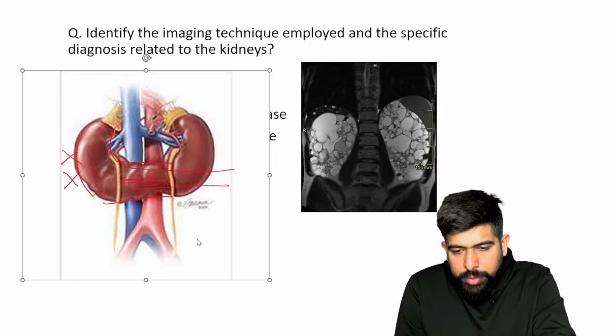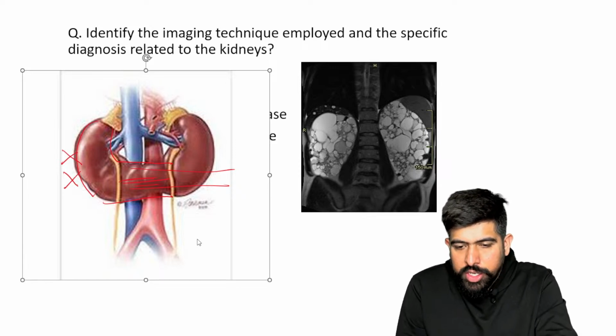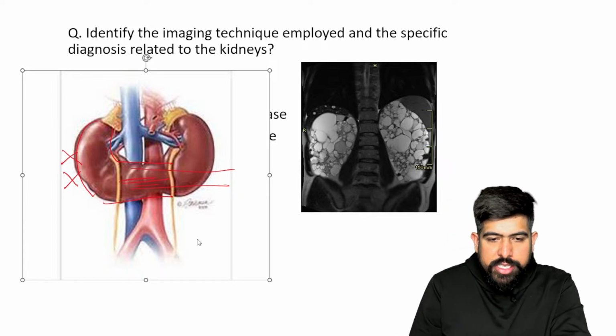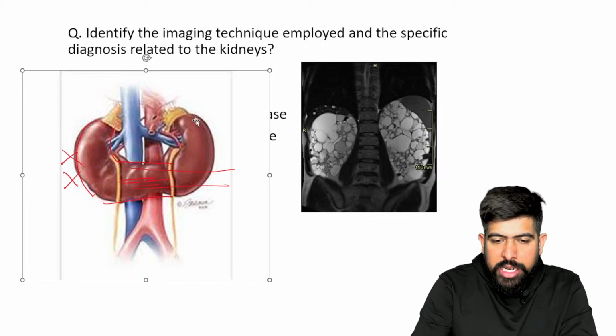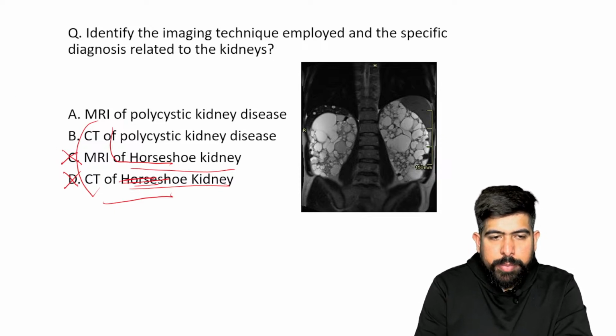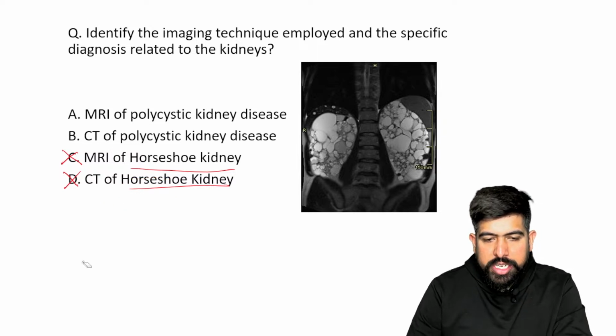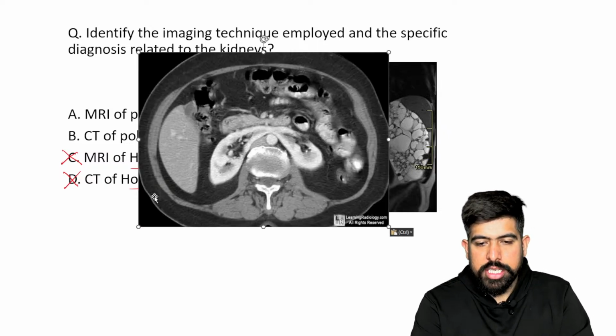Yes, fusion of the kidney will be there. Okay, the fusion of the kidney. Yes, it's clearly not the... It's okay, so no attachment is there. Okay, and also if I'm talking about the horseshoe kidney image, just please remember about it. If I'm talking about the clear radiological image of horseshoe kidney, just wait for it.